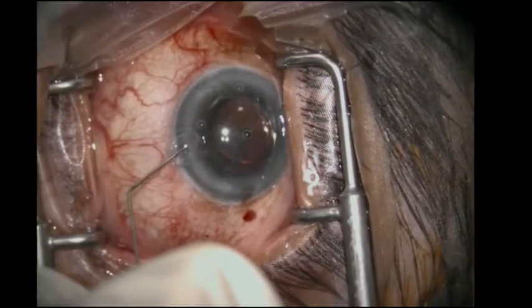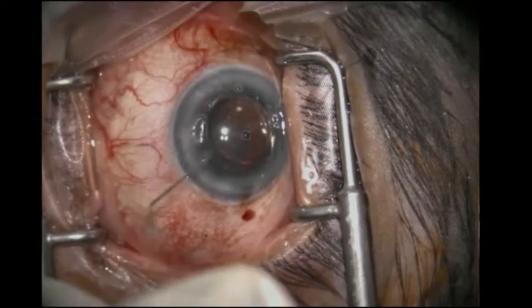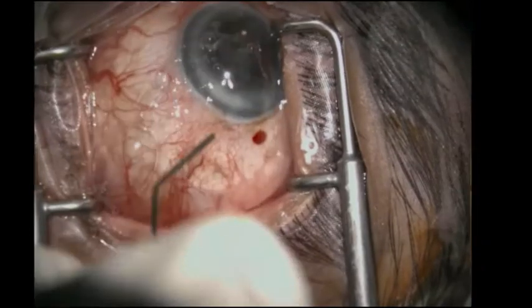Air injection was tried through the side port for deepening of the anterior chamber. This was another difficult process.